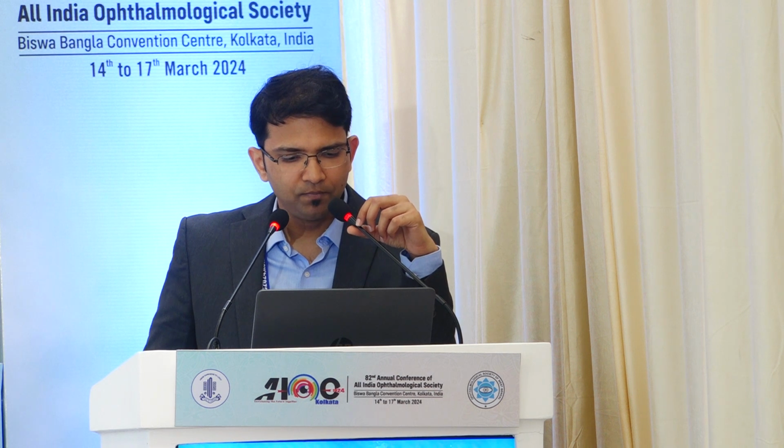So we took the patient for 25 gauge vitrectomy and gave a peribulbar block. And here, after clearing the vitreous hemorrhage, we noted that there was an inferior detachment involving the macular area, and there was an incarceration site in the mid periphery. We cleared the vitreous hemorrhage all around the incarceration site, taking care not to create any inadvertent retinal breaks. And now we are debulking the vitreous overlying the incarceration site.